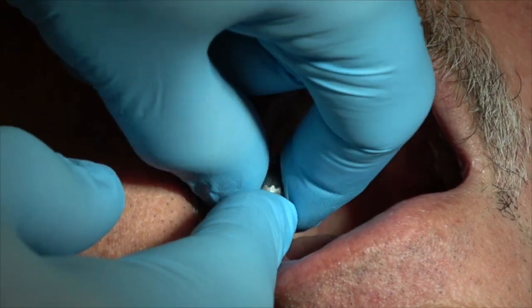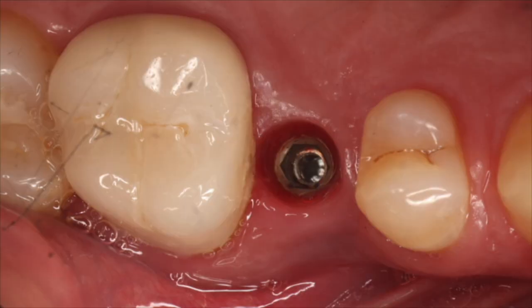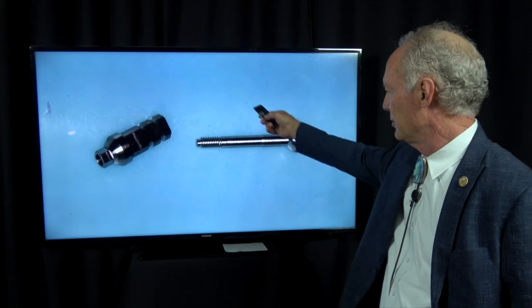Here's the healing abutment — I'm going to unscrew that. The implant was torqued to 35 newton centimeters. Here it is: perfect emergence profile.